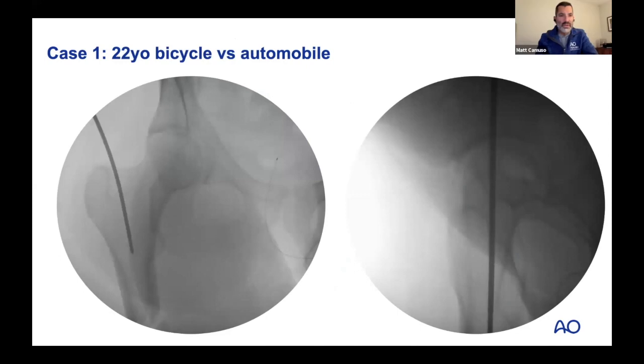So we'll move through this a little bit. I, like Mitch, like to use the piriformis entry because, as you described, if you continue down through the distal femoral condyle, you hit the medial tibial spine. If you go retrograde up the femoral canal, you always exit in the piriformis. And so this is the perfect collinear starting point and entry point, and it works well for me. Every time, I know where it is. It's a perfect spot, and I never can get it wrong. So I use a piriformis entry for these, and this is us, of course, acquiring that.